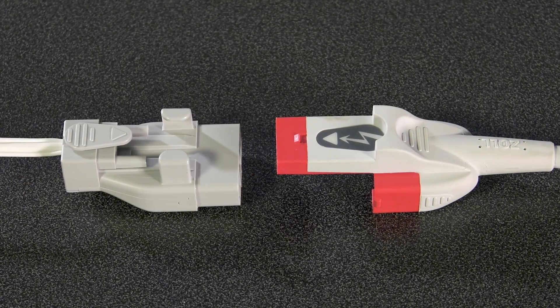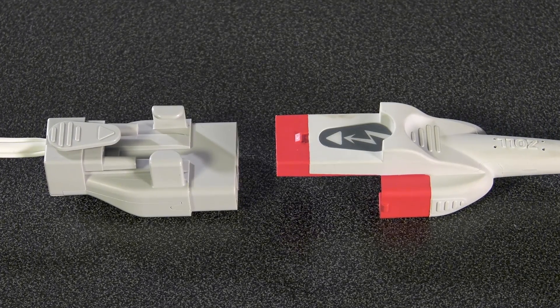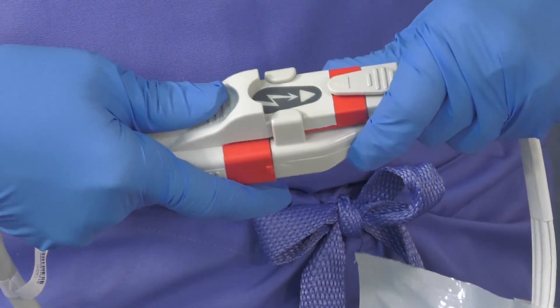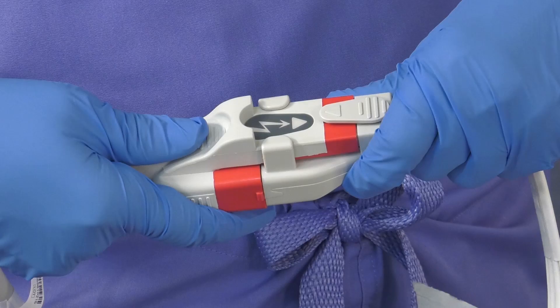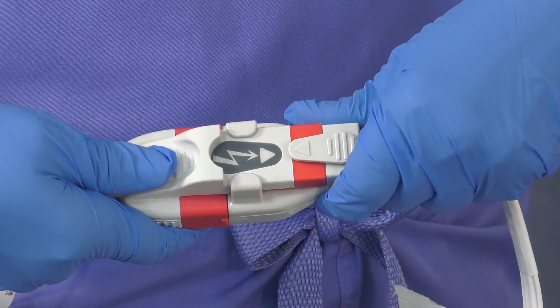One-step electrodes should remain connected to your defibrillator at all times. To connect the electrodes to the one-step cable, slide the end of the cable into the electrode connector. The two largest pieces will connect. They should fit together easily and create a tight connection.